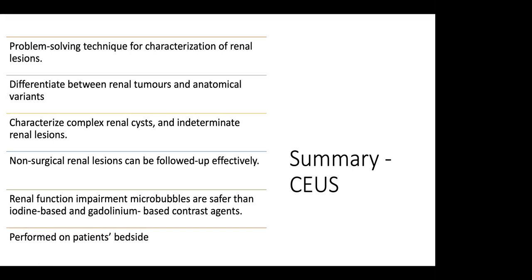But of course, renal evaluation may also require multiple injections, because we have to focus at the upper pole or lower pole, or sometimes at the interpolar region. And as I have previously mentioned, we need the expertise not only for doing, but also for reading the contrast-enhanced ultrasound.